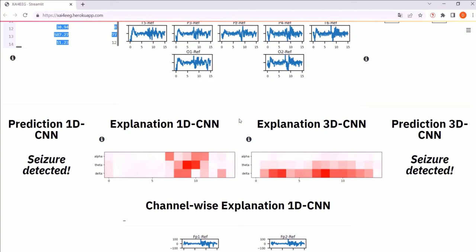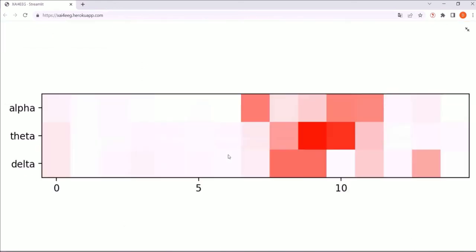To compute the SHAP values of the classifier's predictions, we choose 2 post-hoc explainers from the SHAP package. The first is SHAP Deep Explainer. The second explainer is SHAP Gradient Explainer. The explanation module is based on a grid of size 15 times 3, holding the length 15 seconds of the interval on the x-axis and the 3 frequency bands on the y-axis. While the x-axis constitutes the explanation in the temporal dimensions, the y-axis explains the spectral dimensions.